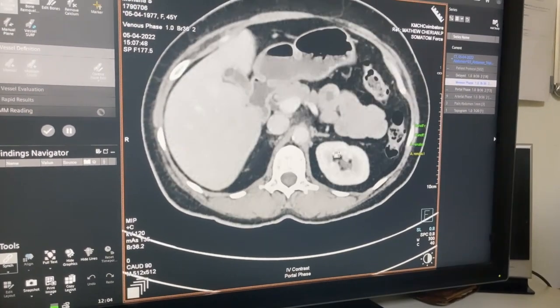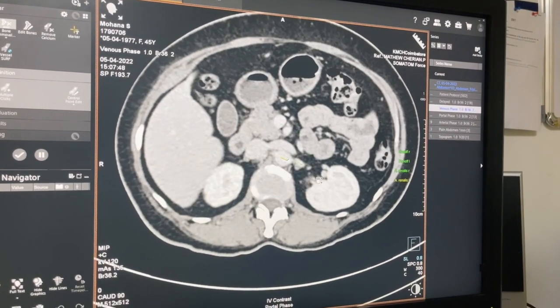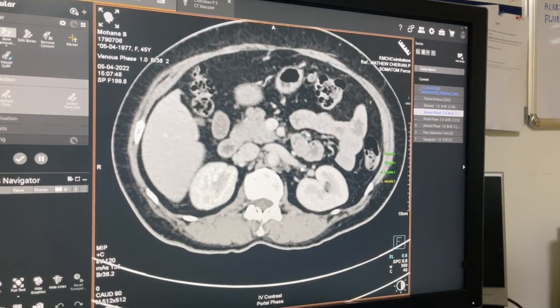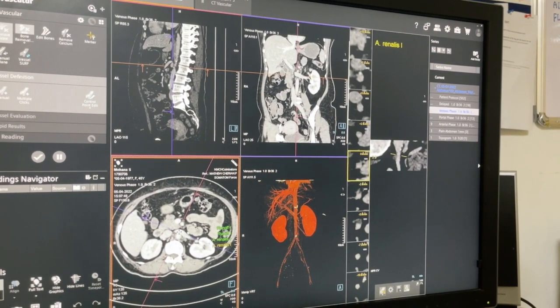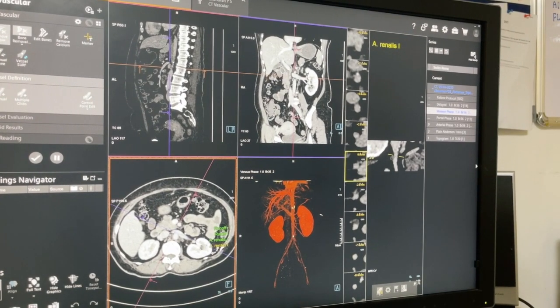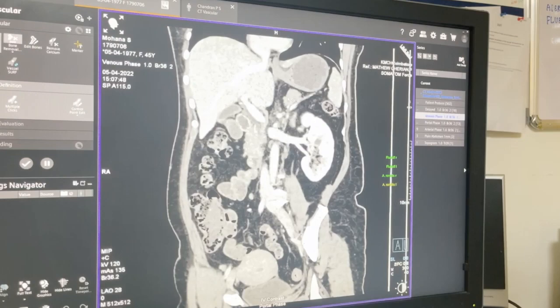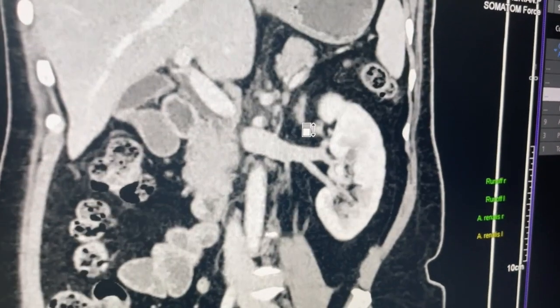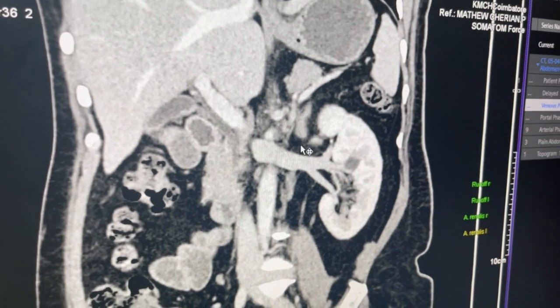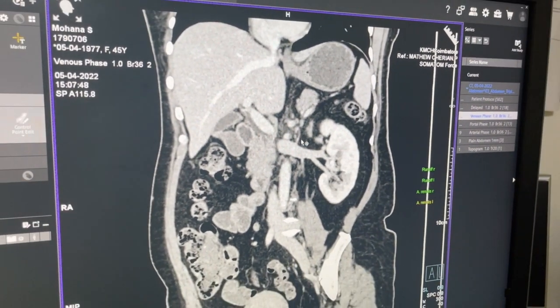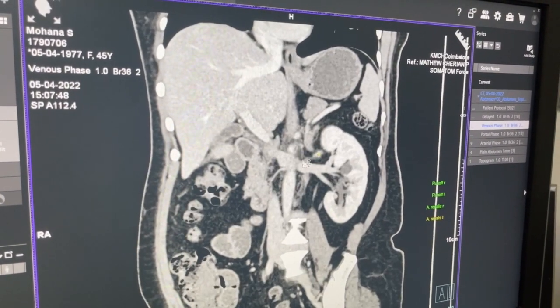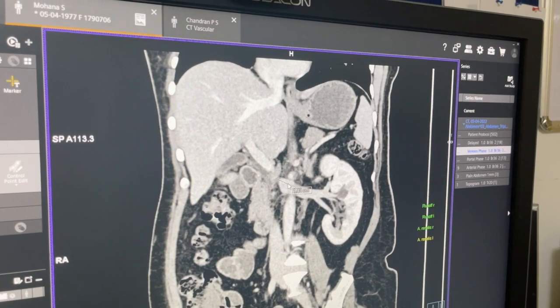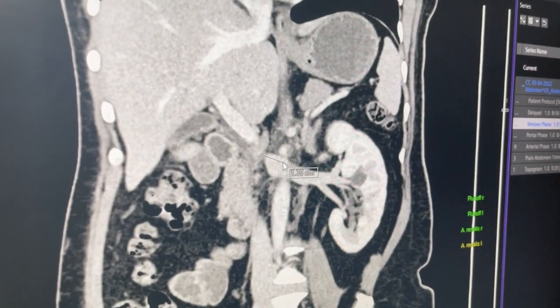The first vein to locate is the left renal because it is technically easy. Here is the IVC, here is the left renal vein, and the left adrenal vein will come from it. Take your cursor and align it along the adrenal vein — using a thin MIP you can see the adrenal vein arising and going up into the adrenal gland. You can actually measure it: from the edge of the IVC it is approximately 1.75 centimeters to the adrenal vein origin.